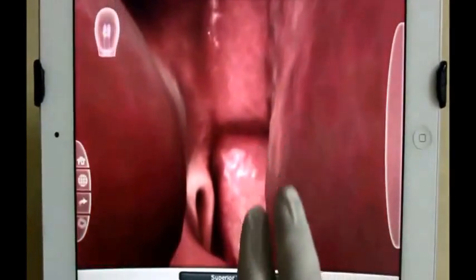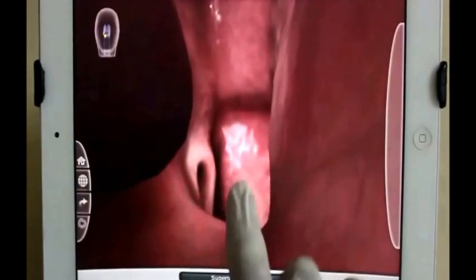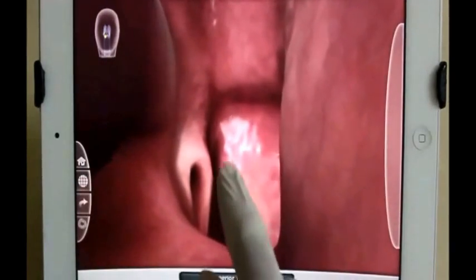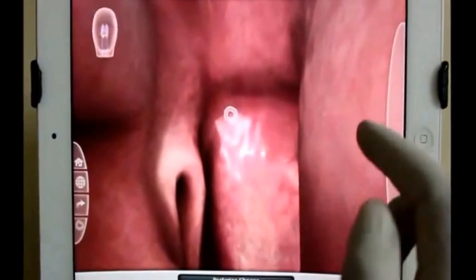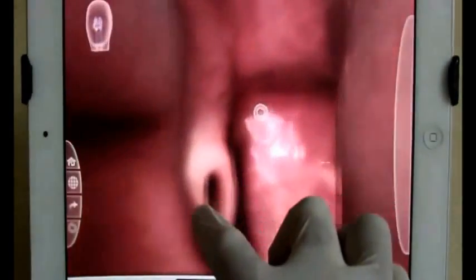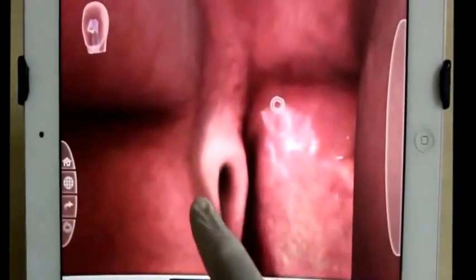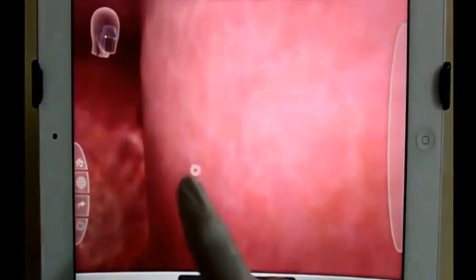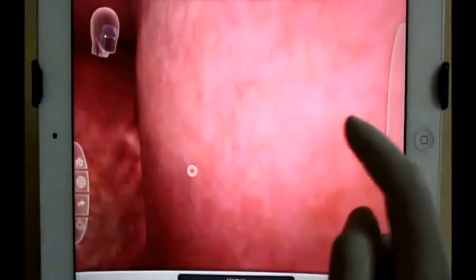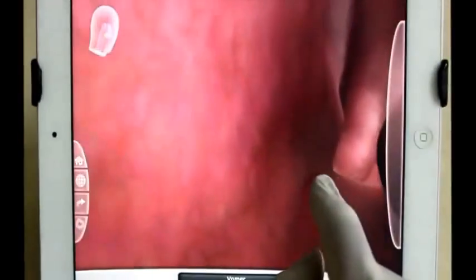Going further more along parallel and perpendicular axes. Here it is the posterior choana. Going back to see the previous structure — here we have the vomer, that is the septal part of the nasal septum, as you can see the whole septum covered.